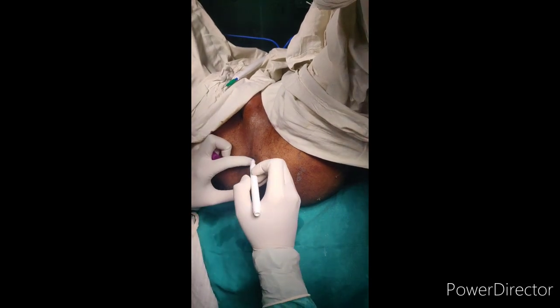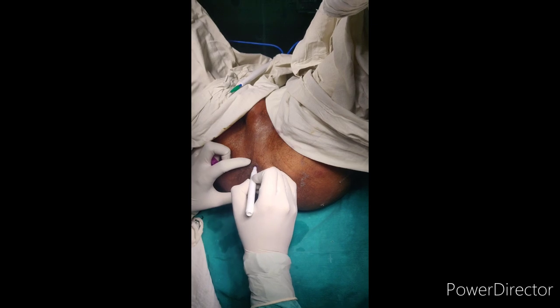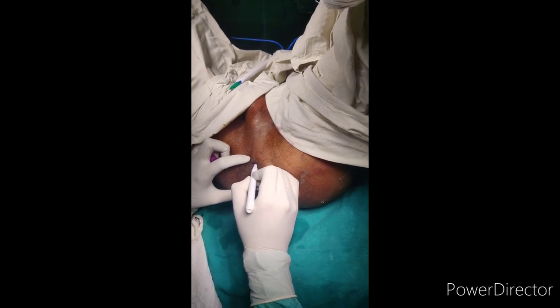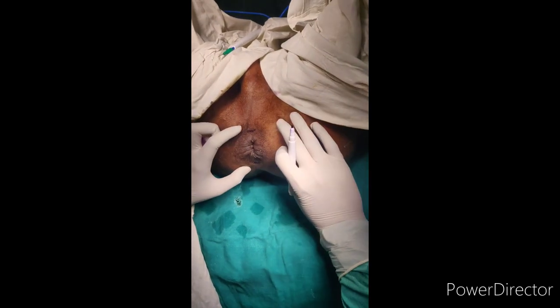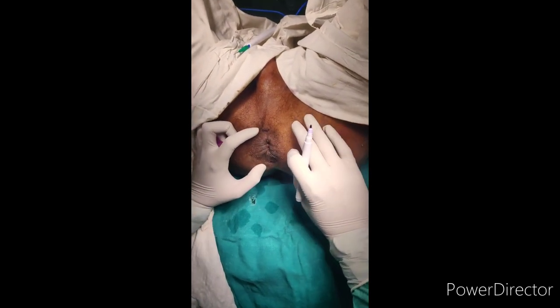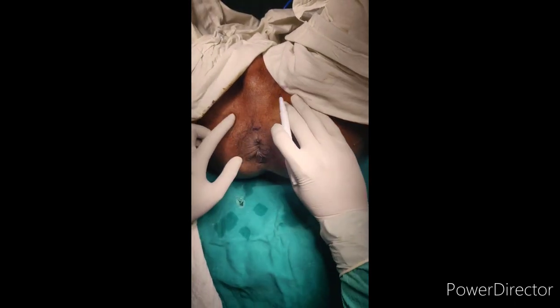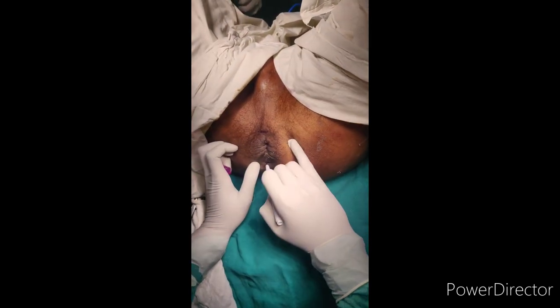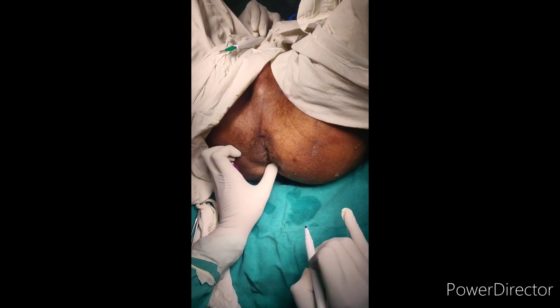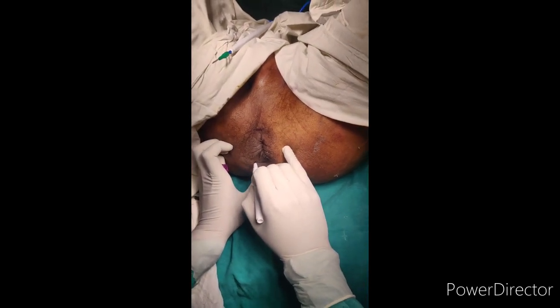It is nothing but placing a non-absorbable suture in the intersphincteric plane. If you see in the procedure, I have marked and palpated the deep sphincter muscle. Below is my entry point and above is the exit point, so I will be palpating the deep sphincter and entering below the superficial external sphincter.